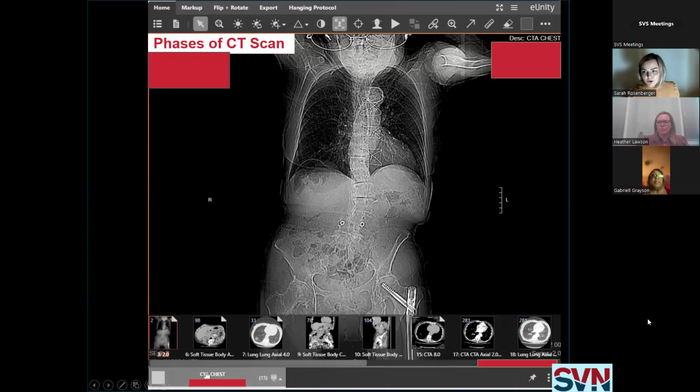You may not know that when you order a CT angiography, or when your patient goes down for one, you are ordering 3 phases, 3 runs through the CAT scanner. The first is a dry scan with no contrast. The second is contrast dye that's timed with a heartbeat, so we can see how the blood is flowing through the arteries. The third is a delay phase. They wait about 3 to 5 minutes, and then there's saturation of the contrast dye in all the arteries and veins, and you can get a delayed picture of where blood flow is getting at a slower pace. You can know which image is which by looking at the small numbers on each series. If there are only 2 images in a series, that's the scout image.